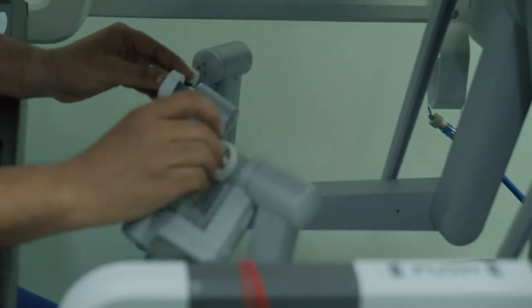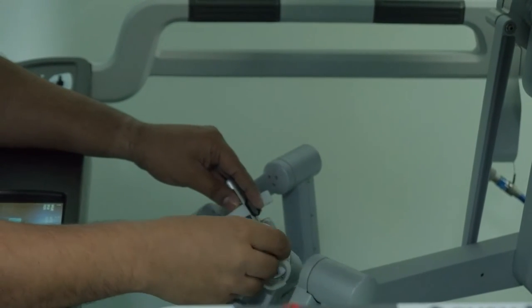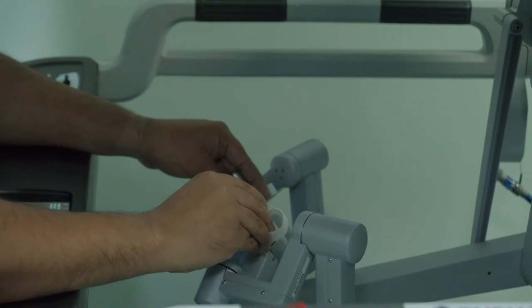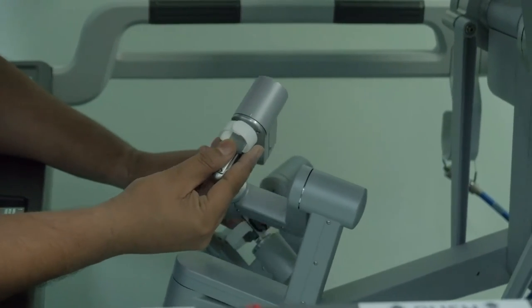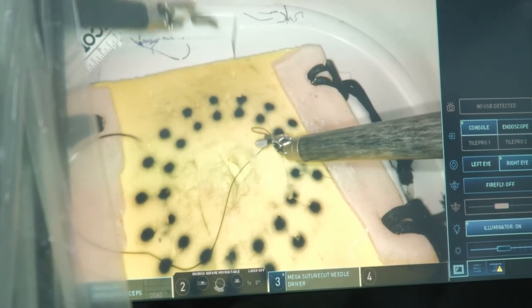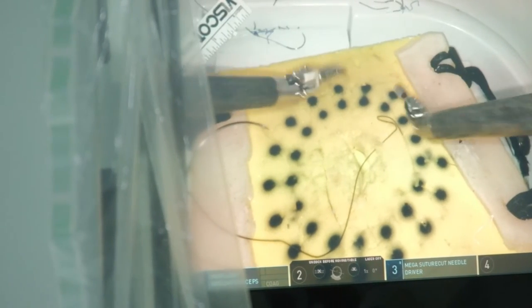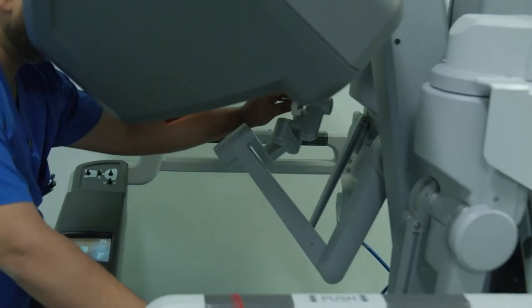Here, we are using these hand controls to take a suture bite, and there is a needle which is being driven. So, these hand controls should absolutely be in the middle of the surgical field. So if my hand controller is going here, I can finger clutch it and bring it back. If I do not do this, then I will be operating like this, which is not good. I don't want to operate like this. I want to operate like this. And this is what happens initially most of the time.